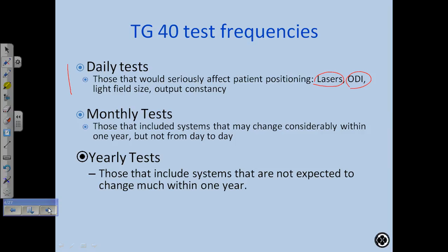So it's a light source, and the light source doesn't move. The light source shines through this really thin screen. The screen is an etched piece of metal that really doesn't change. So it really doesn't change much, but it can affect patients' treatment. But since you use it so often, you want to check it.